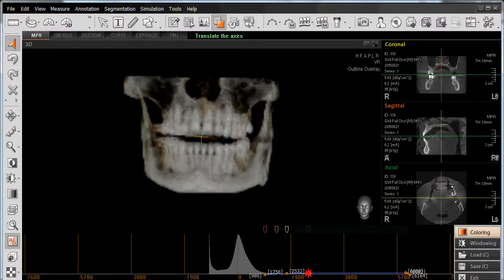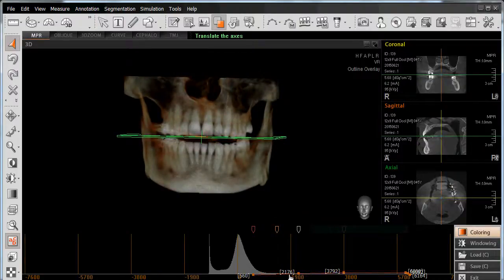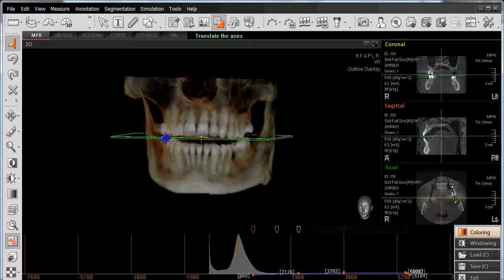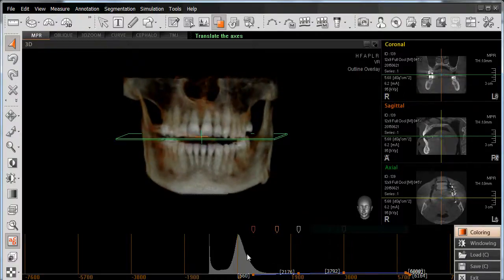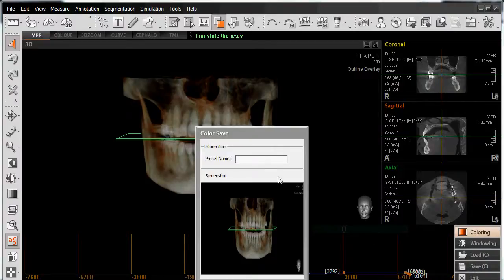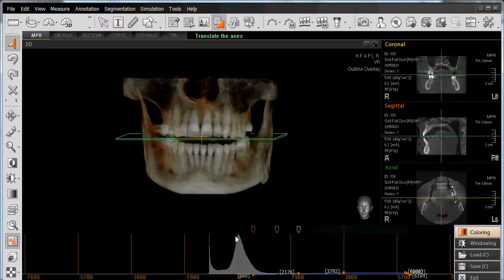I'm going to left-click on the color range box and add more color, then go down a little further on my density range. Once I've selected the proper view — segmenting out my density, color, and opacity — I have the ability to save these values as an opacity preset. This is where the menu comes into play. I'll left-click on Save, assign a name such as 'ortho view,' left-click Save, and now I have saved this opacity preset to my opacity library.